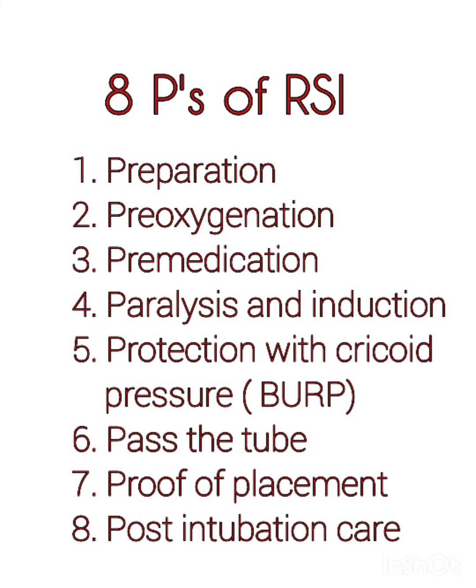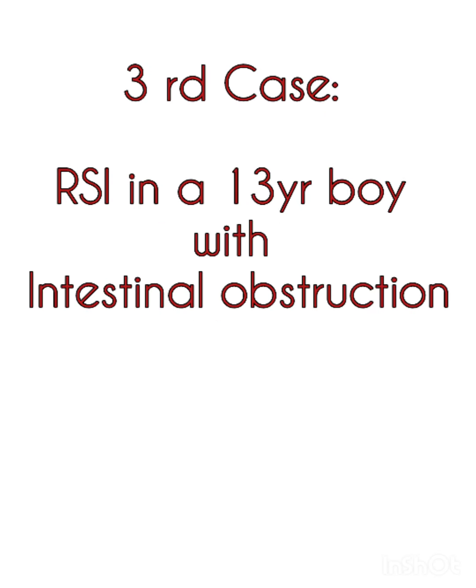The essential components of rapid sequence induction are preparation, pre-oxygenation, pre-medication, paralysis with induction, protection with cricoid pressure, passing the tube, that is intubation, proof of placement, and post-intubation care. The third case today is of rapid sequence induction in a 13-year-old boy for emergency laparotomy for intestinal obstruction.